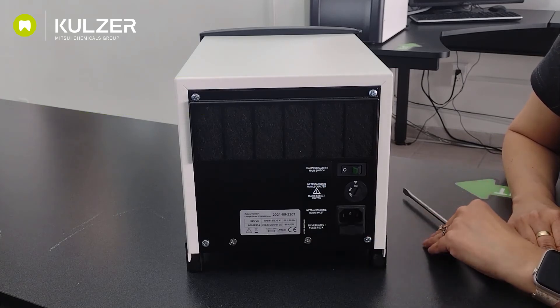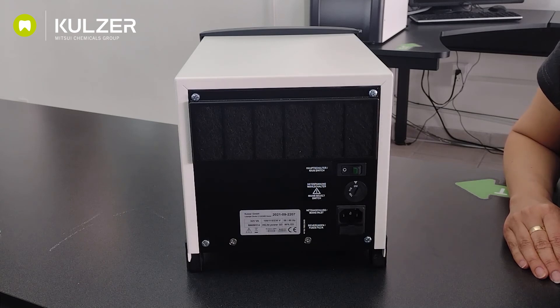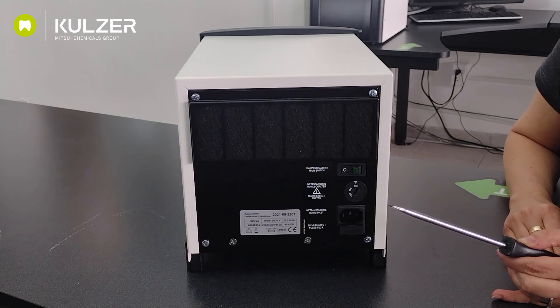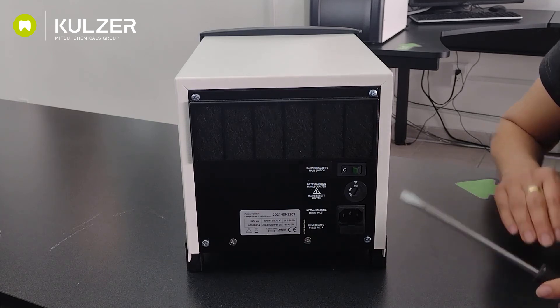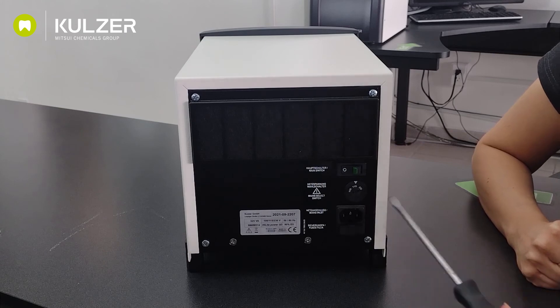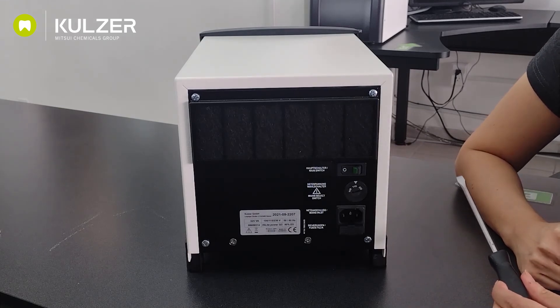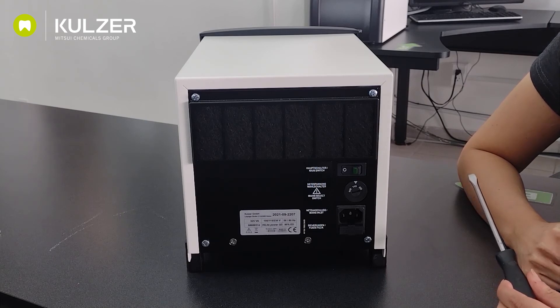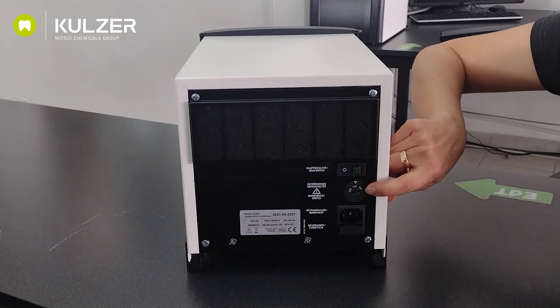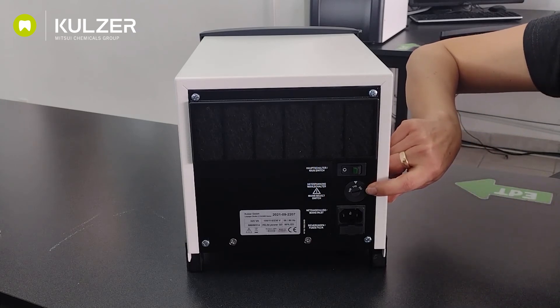This is the voltage selector, where we choose the voltage according to the mains voltage we work with in our lab. To change the settings, we use a flathead screwdriver. In most Mexican labs, we will find between 110 and 120 volts, and therefore we can select here the 115 volt position. In most European countries, we would choose the 220V position as this is the mains voltage there. This is also the position to choose if we have a biphasic installation of 220 volts in our laboratory. Very important: do not switch this voltage selector while the device is on, because the device could be damaged.